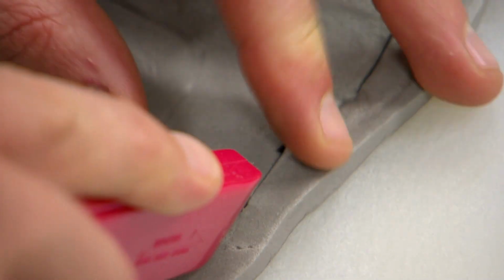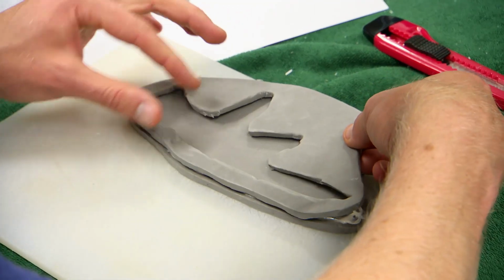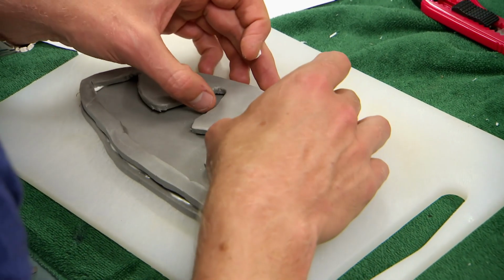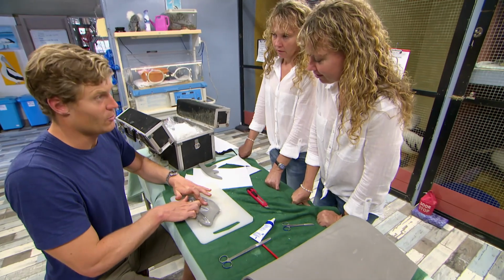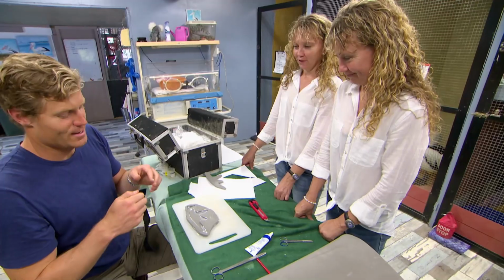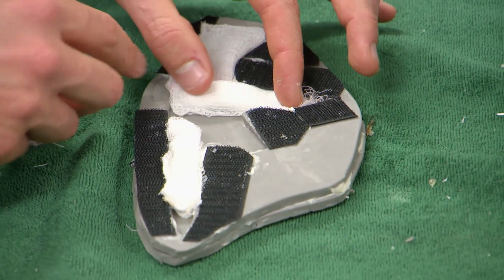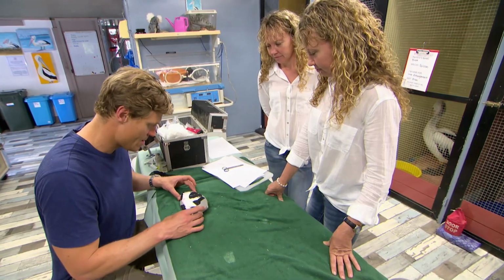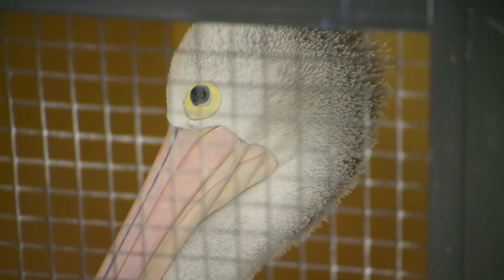Pretty sure I haven't done this much arts and crafts since kindergarten. Right, so that's Flip's new foot. Yes. You can see where her existing foot is going to go in. And then, once those little toes are in there, we need to now secure them across the top. Okay. And the way we're going to do that is with this. Good old Velcro. As Flipper waits patiently, Chris is attaching the Velcro that will help keep the shoe in place, along with some cushioning. Okay. Yes. I think I'm ready for our patient. Okay. Good girl.